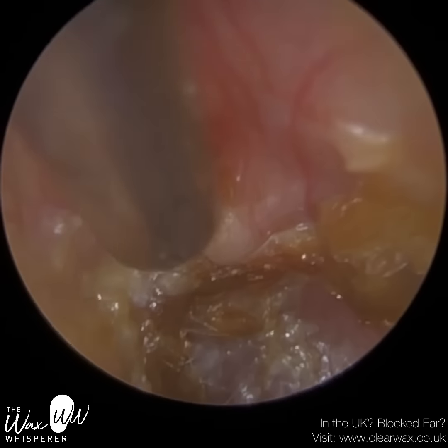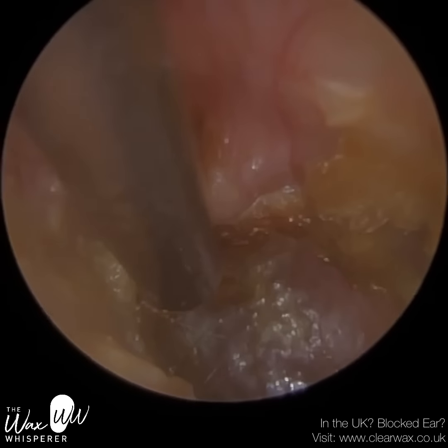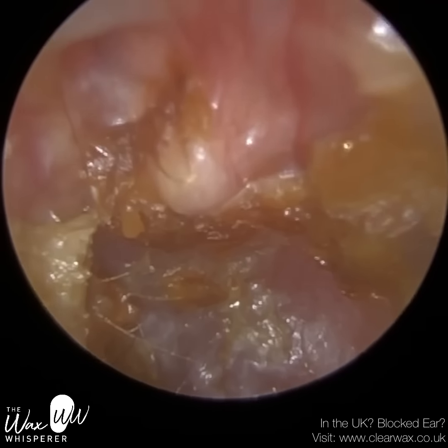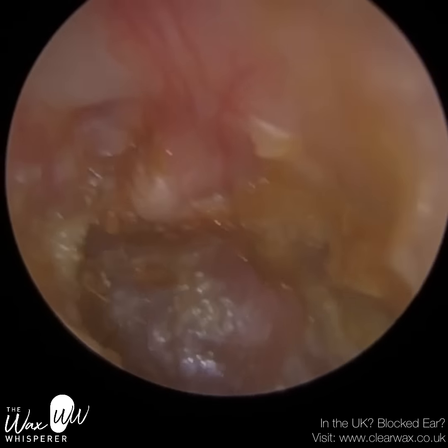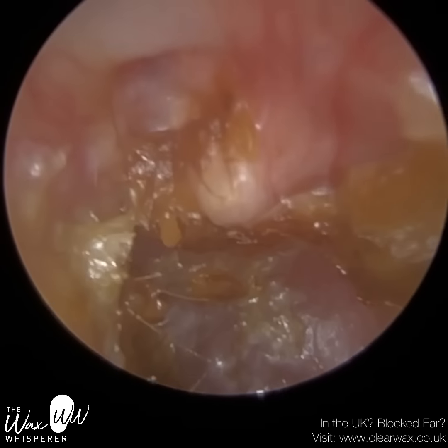A cholesteatoma is when dead skin that normally sheds and migrates off the eardrum can collect in that pocket at the top. And you can see there's a bit of skin there, but it's actually not in the pocket. You can see I'm having a really close examination there. And it's not embedded, so it's kind of self-migrating, which is good. So it's just a little bit around the hammer bone.